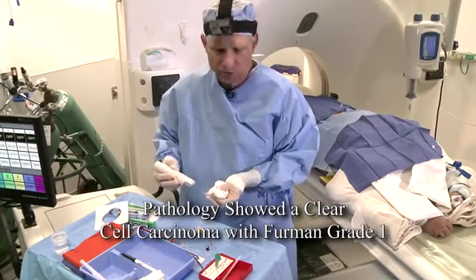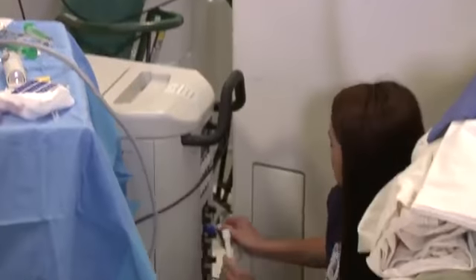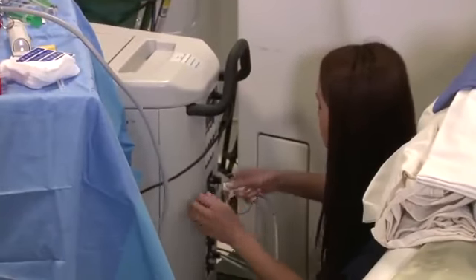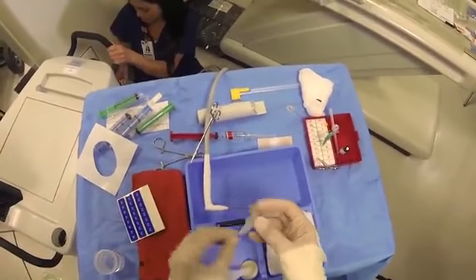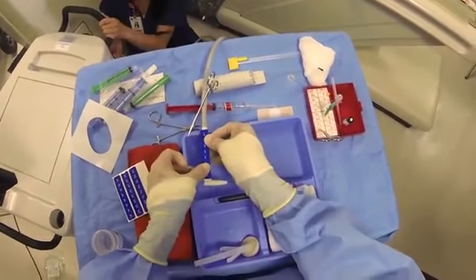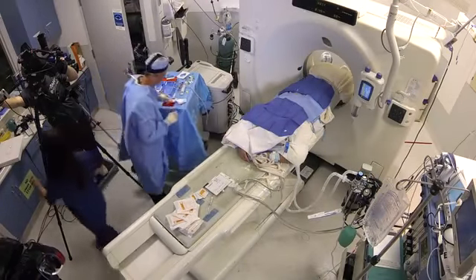Okay, let's get a Perc 24 out and we'll test it. Michelle's going to hook the probe into the front of the machine. Which port are you choosing? 1. And I'll mark this probe as number 1. We've got the probe in our saline.